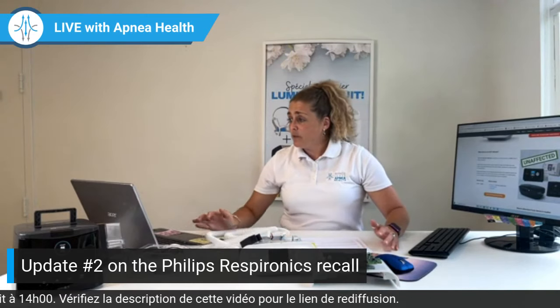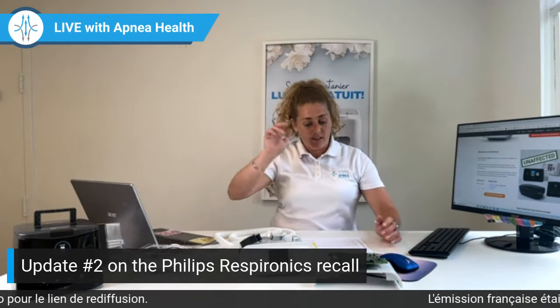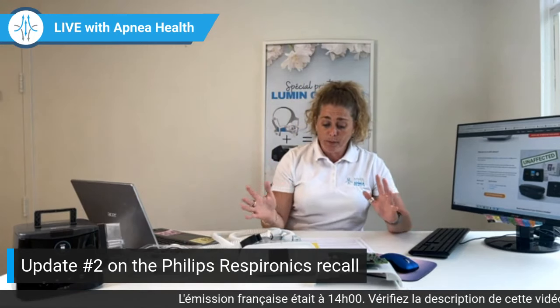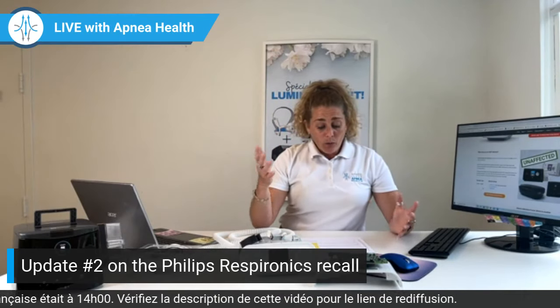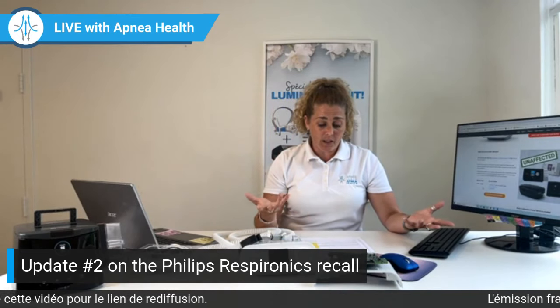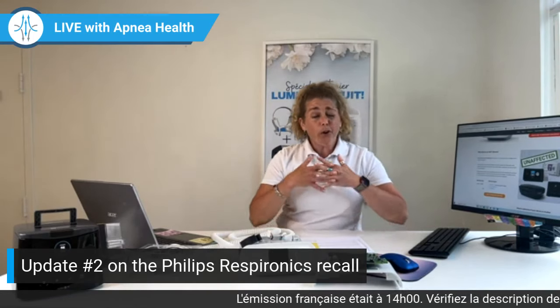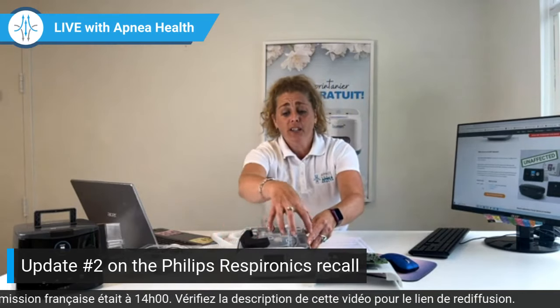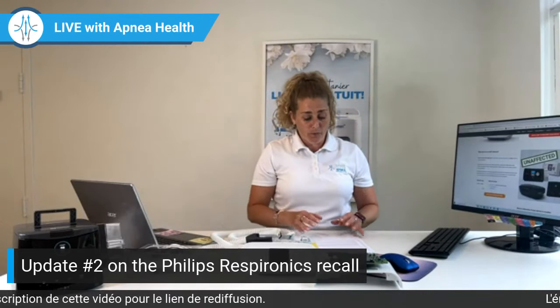So, to get back to the information, right now Philips hasn't indicated if the CPAP will be refurbished, or if they'll replace the sound barrier foam, or if they'll replace the machine altogether. We are not sure yet. I know that our representative believes that the DreamStation devices will be replaced, while older models might be refurbished, or they might just change the part that has the foam in it and replace it with the proper foam.